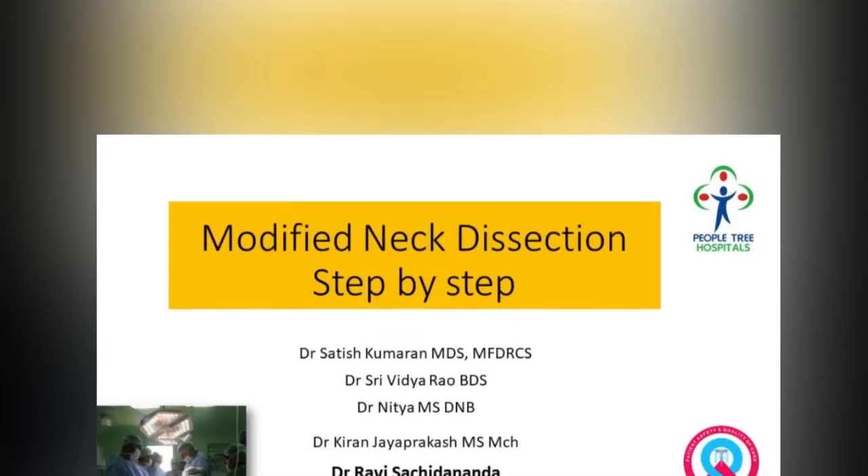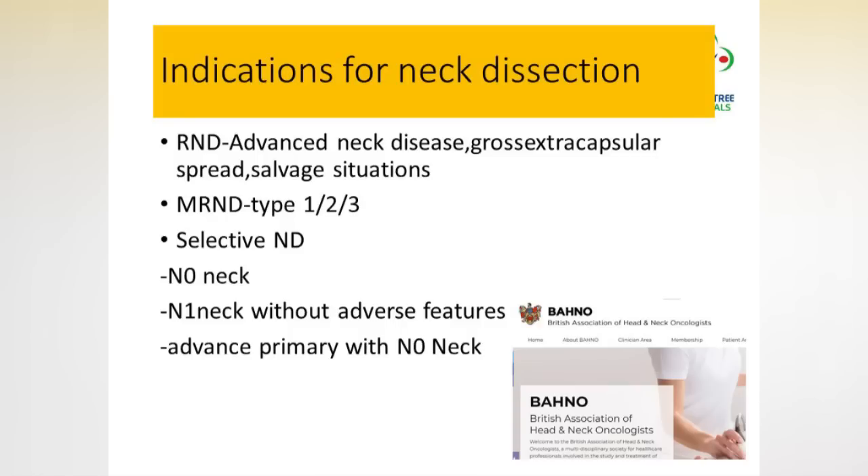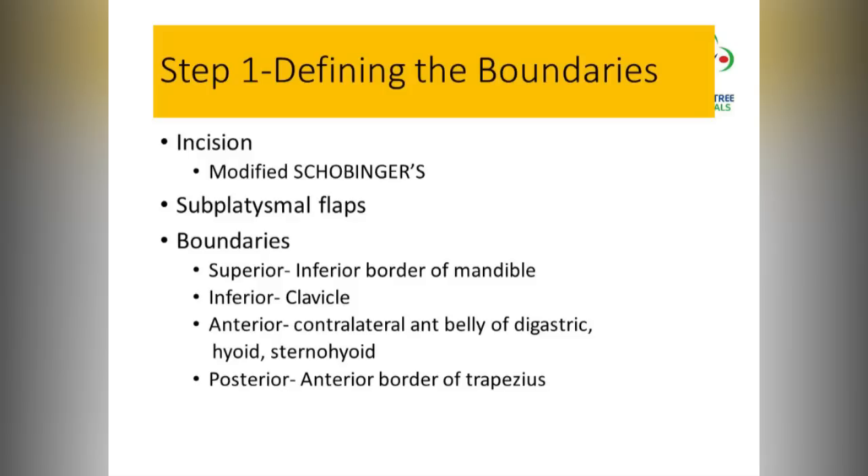This is Dr. Ravi demonstrating a modified neck dissection, which is comprehensive clearance of level 1 to 5 nodes.